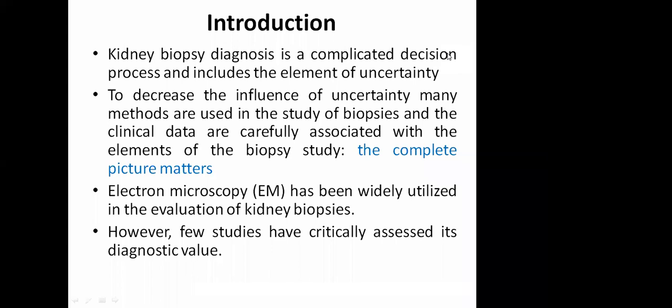If light microscopy is showing a morphology of membranous glomerulopathy, we expect there should be IgG, surely, along the capillary loops. If IgG is there along the capillary loops, that makes our life simpler, and we diagnose this as membranous if C1q is not there. And now we have PLA2R and thrombospondin, and by doing that, we can categorize membranous, whether it is primary or secondary, and whether it is PLA2R or thrombospondin associated. And now there are one or two more antibodies, like NELL1 associated MGN.